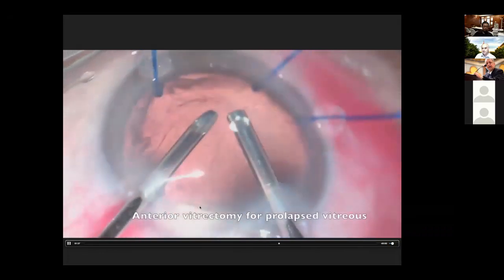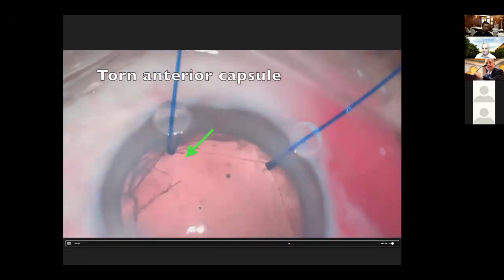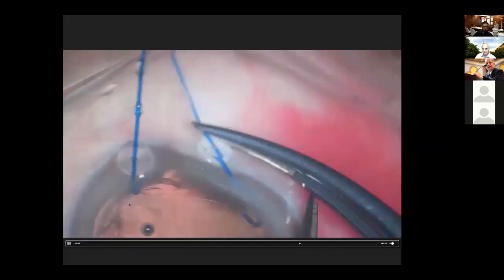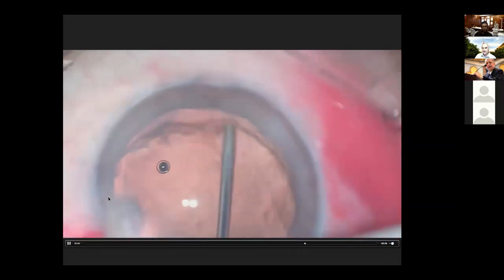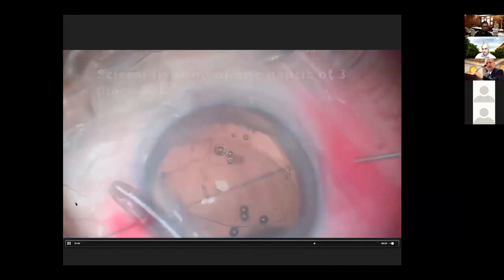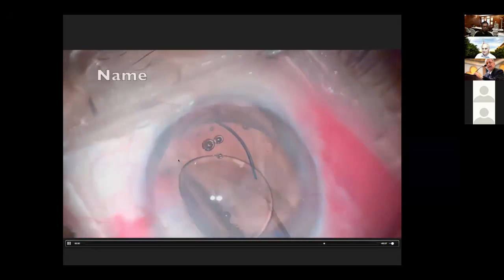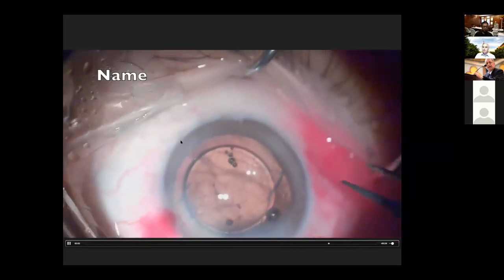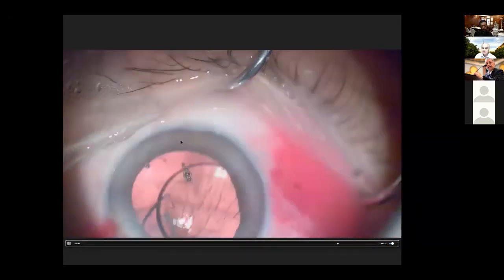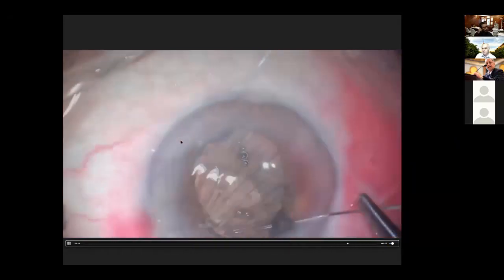So you have to remove it to allow the bag to be centered. You can see the tear, it's a big tear. And once you have an open capsule, you cannot put a capsular tension ring. So I decided to do a scleral fixation, one haptic scleral fixation, because this is traumatic subluxation. It is not a progressive pathology. So at the area of subluxation, where the zonules are deficient, I'm going to fix the lens.